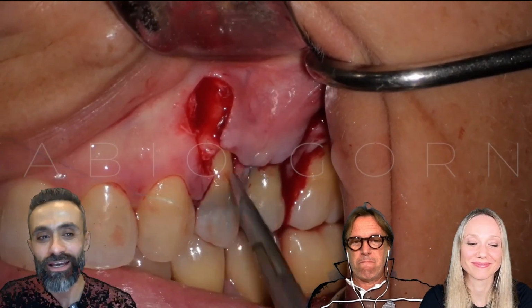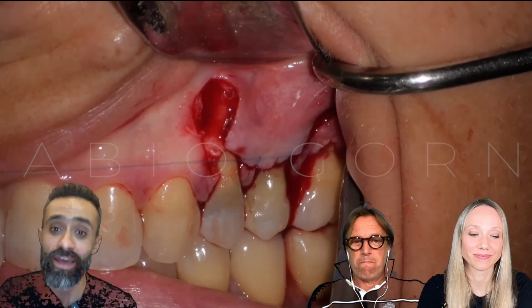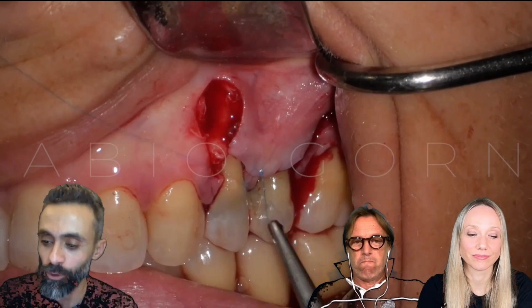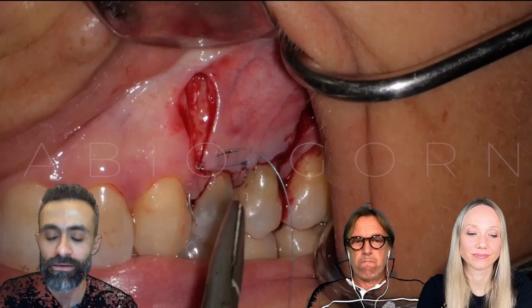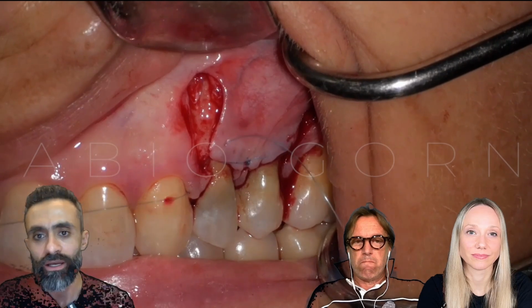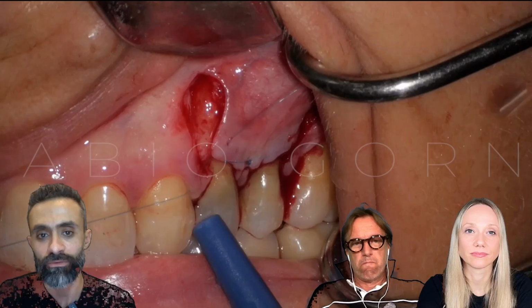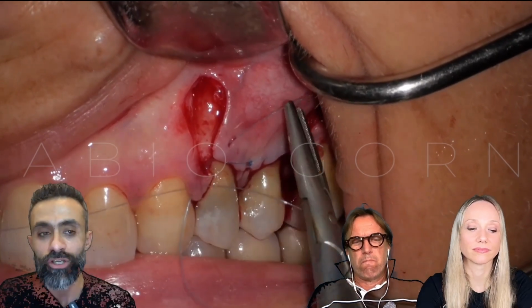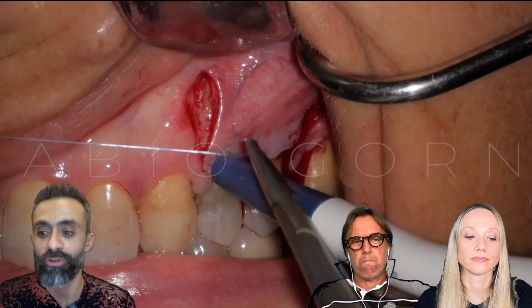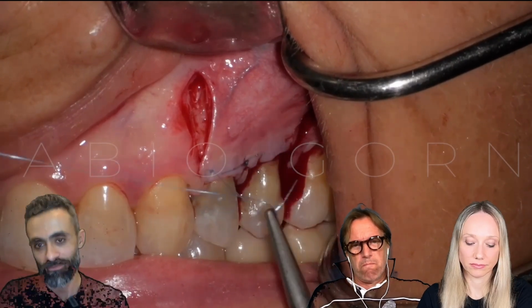So now we are reaching the end of the case, or the last thing in the case, which is very important in my opinion, which is the suture, putting back the flap in its place and suturing. What material are you using currently for suturing? And there is a very important question from colleagues, because they want to practice suturing to excel at it. So what's your advice to them to practice the suture to be just like a brain surgery?